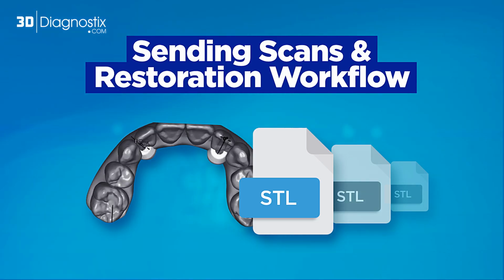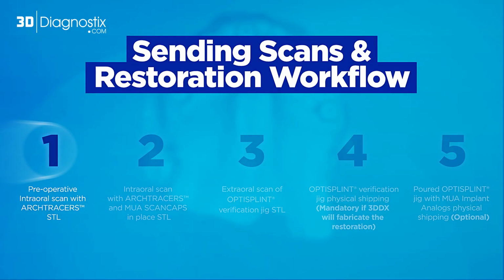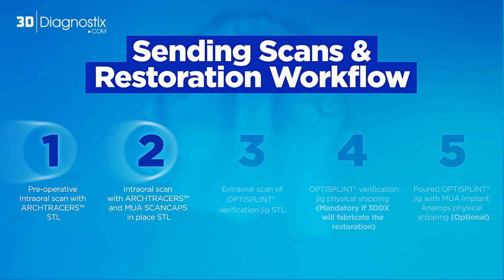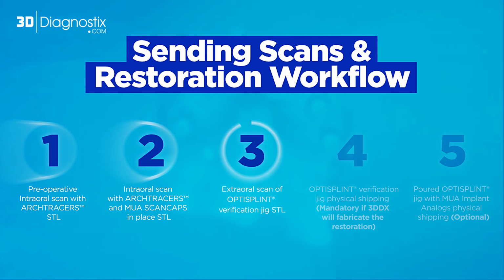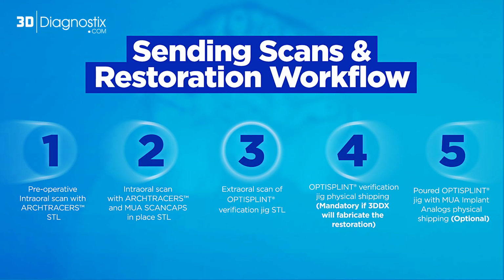The required records include the following: 1. Preoperative intraoral scan with arch tracers. 2. Intraoral scan with arch tracers and MUA scan caps in place. 3. Extraoral scan of OPTISPLINT Verification Jig. 4. OPTISPLINT Verification Jig. 5. Poured OPTISPLINT Verification Jig with MUA implant analogs.